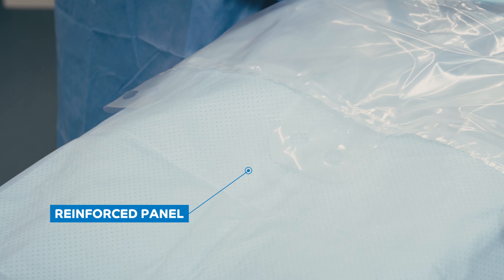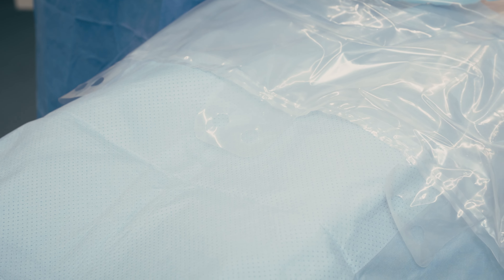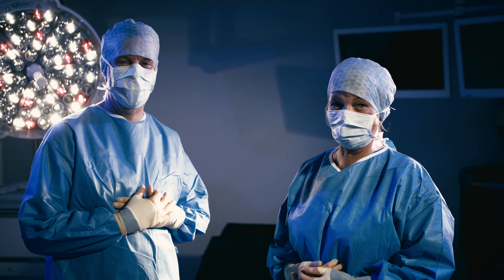In addition, this drape features a reinforced panel to provide additional strength and absorbency. The Guardian C-section drape — protecting you with confidence.